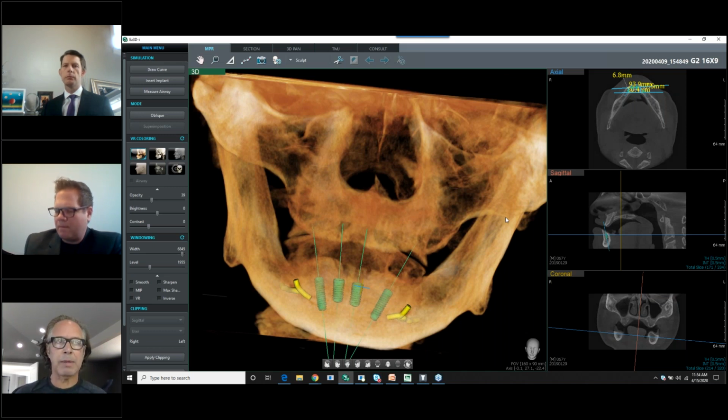I mean, for those of us who work with any type of x-ray, much less what we're looking at in front of us, the patient looks at this and goes, oh my gosh, is that me? Wow, that's so wild. And all of a sudden they associate with it.